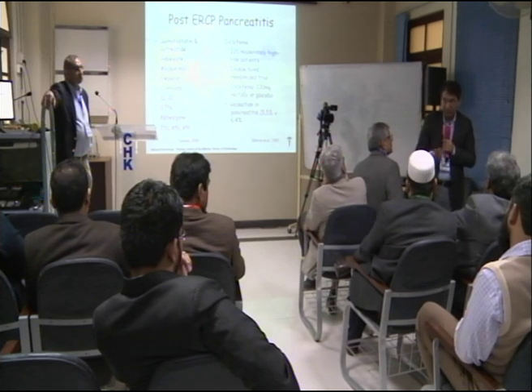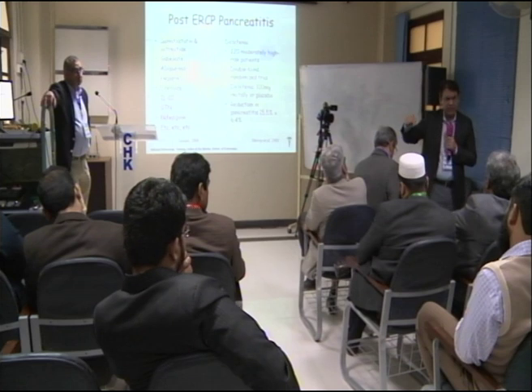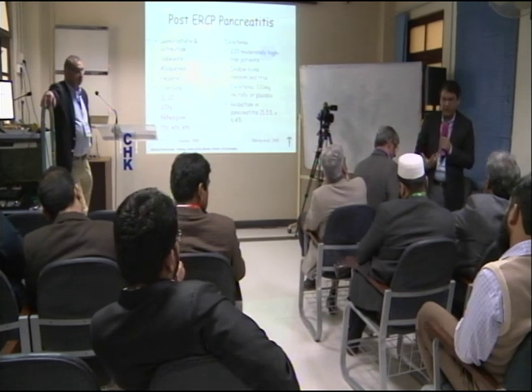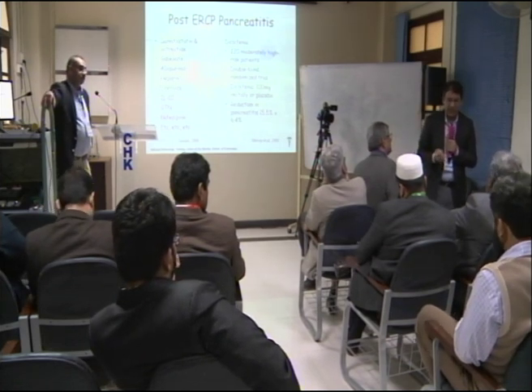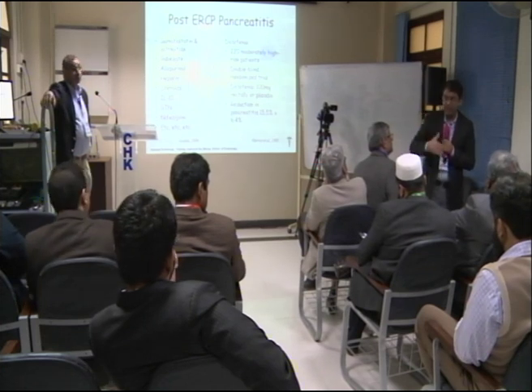So just remember that. And if there is an ANSA loop in there and you're trying to prevent post-ERCP pancreatitis by putting a stent, you actually are causing a lot more damage in there than ERCP was going to cause.